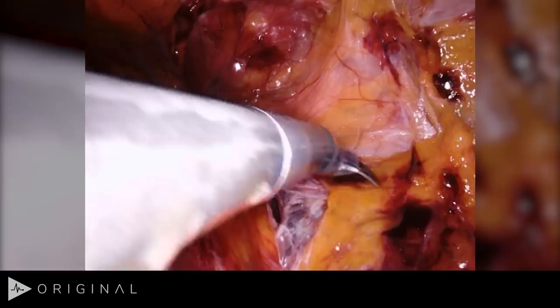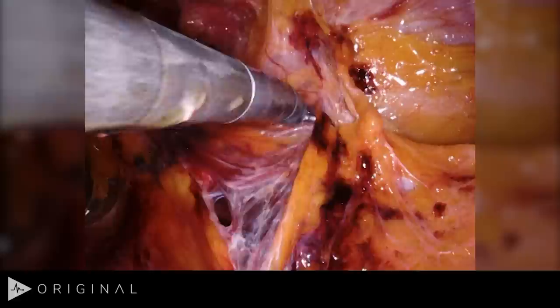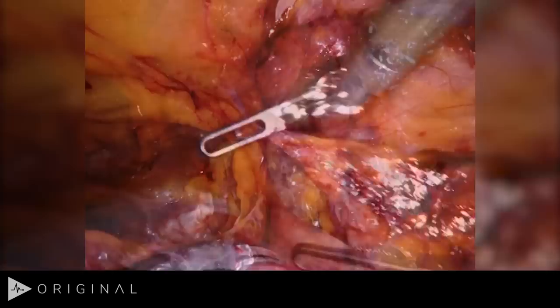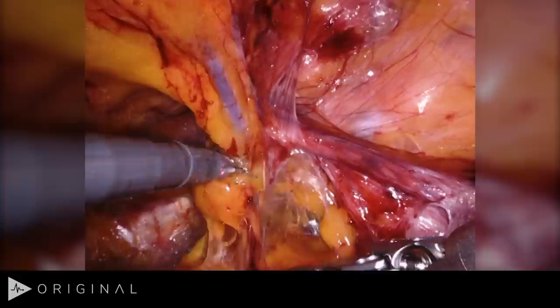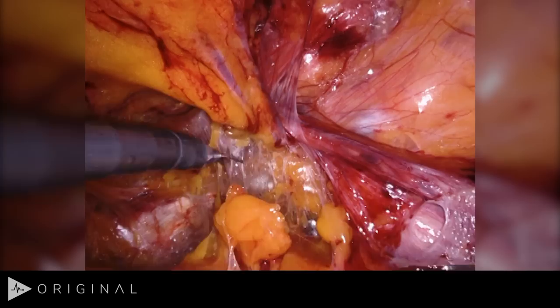The move is to sweep like this — that drops the gonadals onto the floor. You can see there's a plane here that will develop. I'm starting to see my vas and do my medial dissection. There's always a bunch of fat that travels along with the inferior epigastric — you can drop that fat with you. This takes us right down to Cooper's ligament. There's a lot of fat along the inferior epigastric; you don't need to totally defat it. This is down at the femoral canal area.